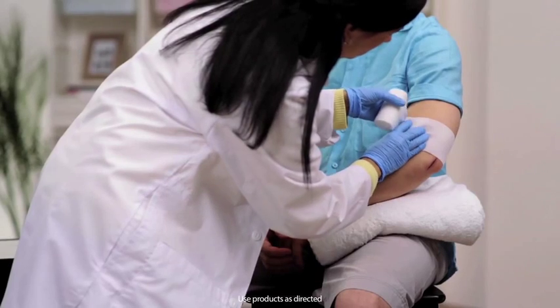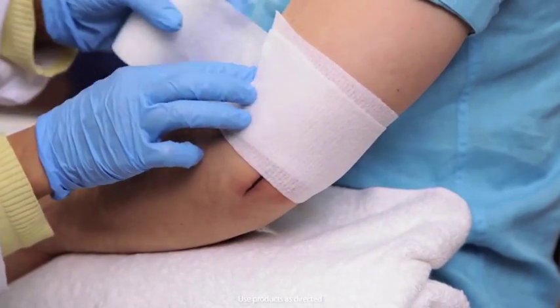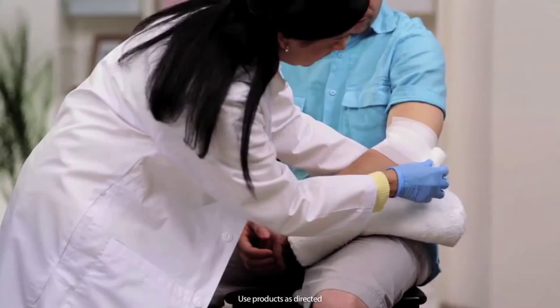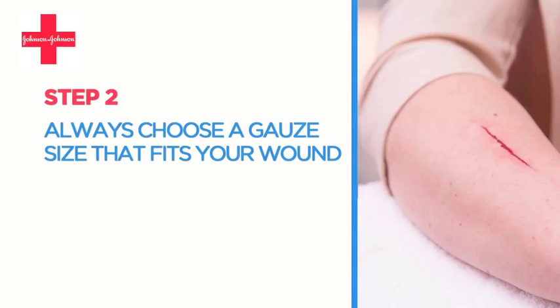Rolled gauze is also great for hard-to-cover areas like the knees, elbows, and feet. In all stages of healing, be sure to choose a gauze size that fits your wound.